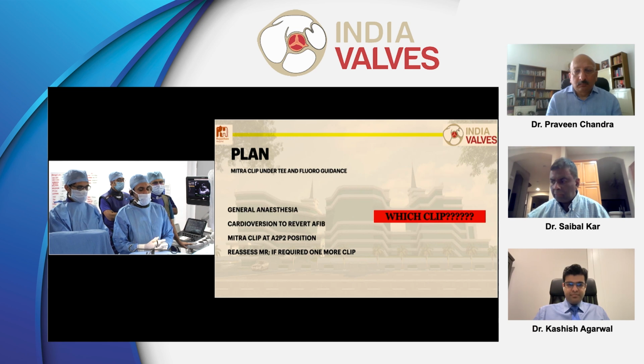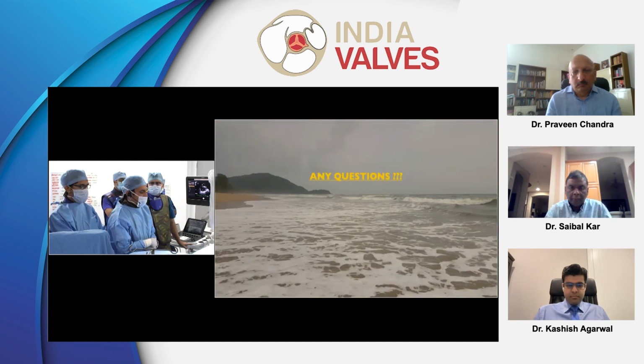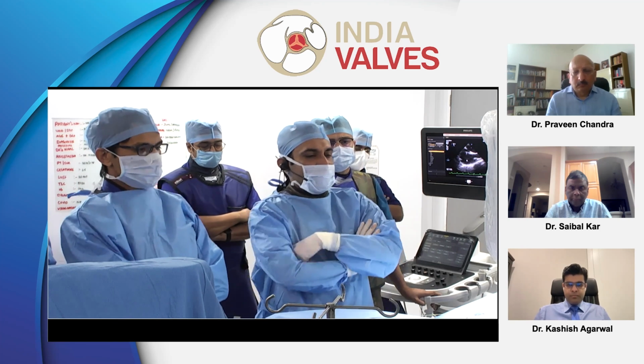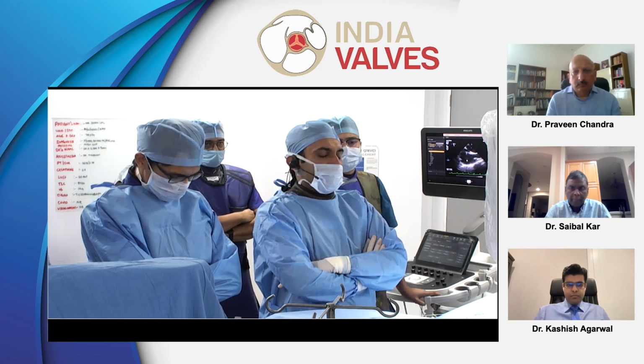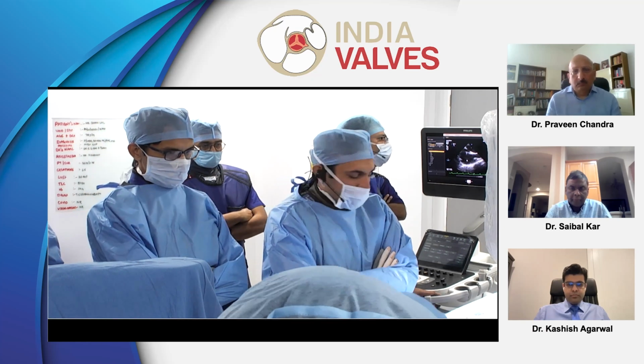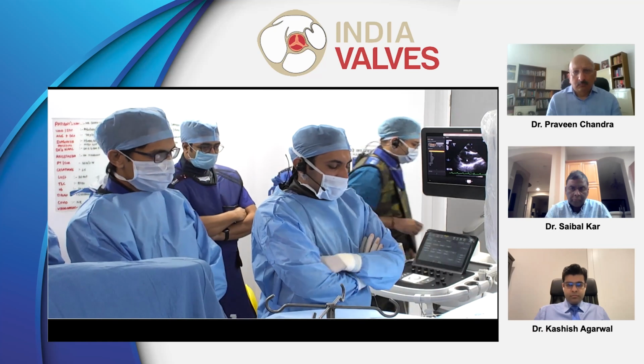What clip to use: NT, NTR, XTR, NTW, XTW, all these things which we can discuss. So I think with that presentation, elderly patient, 78-year-old post-CABG, clearly not a candidate for redo surgery. We have selected this patient for a MitraClip procedure. Over to you, Dr. Praveen Chandra, Dr. Saibal Kar, and Kashish.